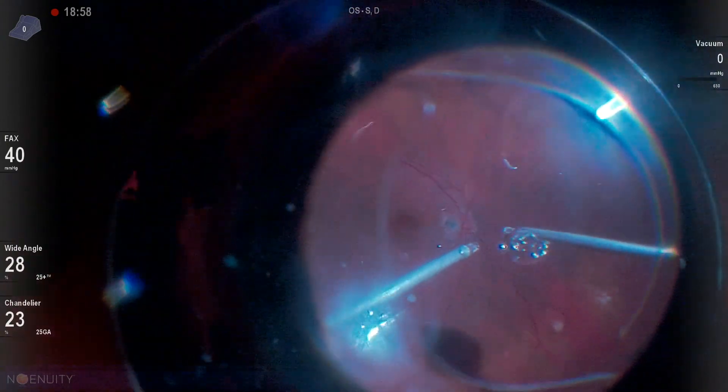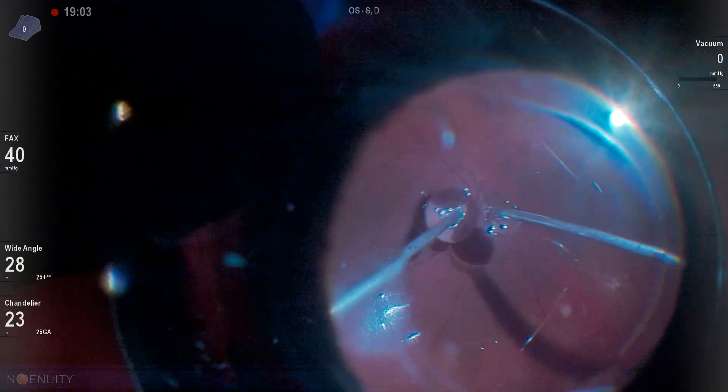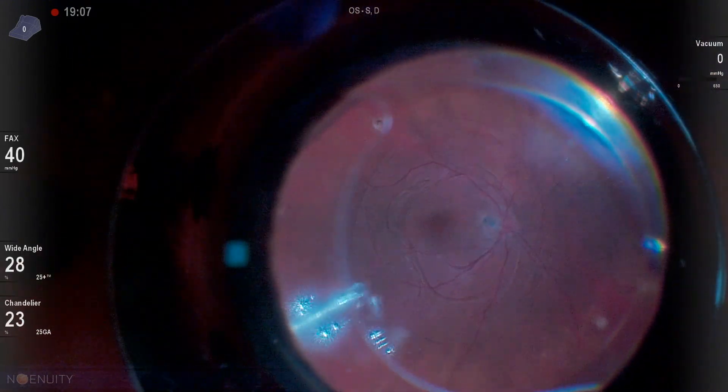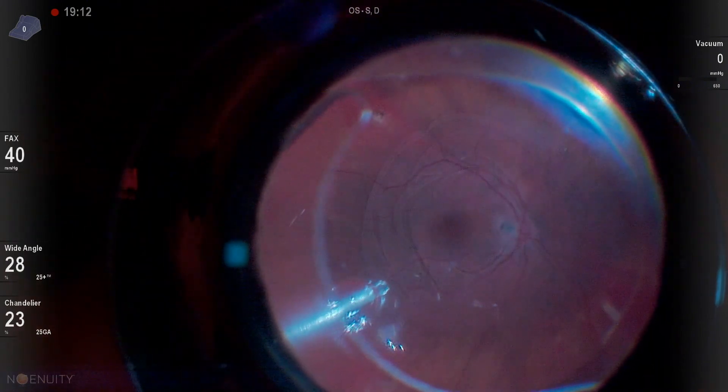Now I have my glue in on a soft tip, and I'm basically injecting glue and activator at the same time. It'll go over the macula here, as well as the optic nerve. And it'll get this kind of semi-opaque appearance. You can still see through it, but it just doesn't look right.